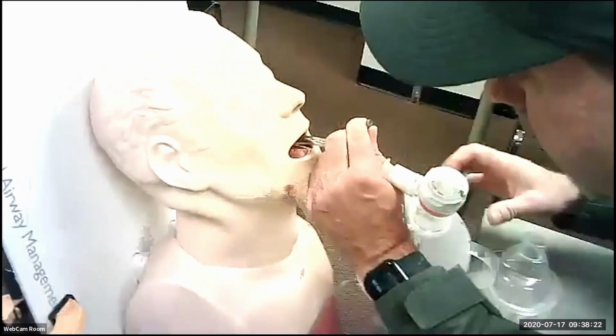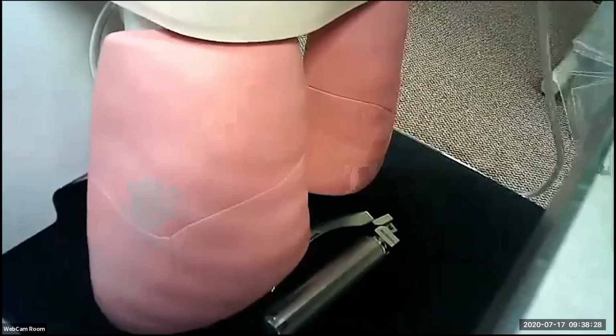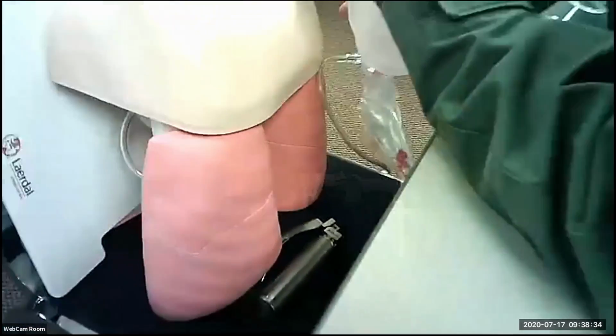And now I'm going to go ahead and breathe for them. Both lungs are inflating. I'm going to slow my breathing rate down. My best indication for good placement is several different things.